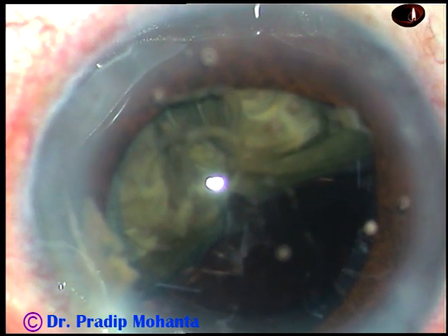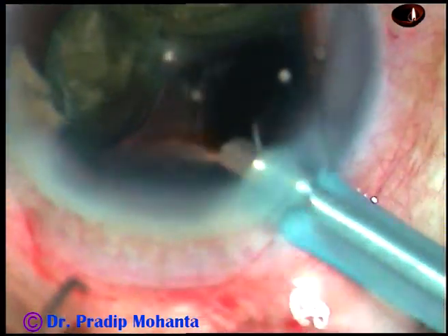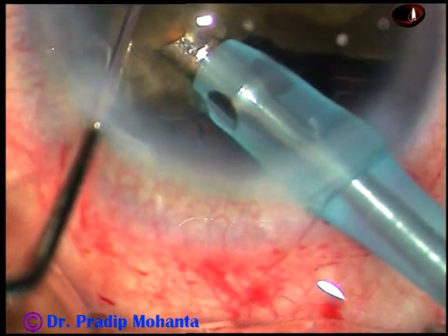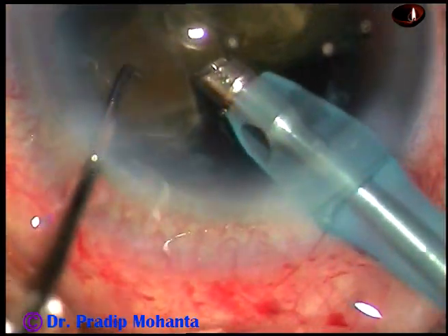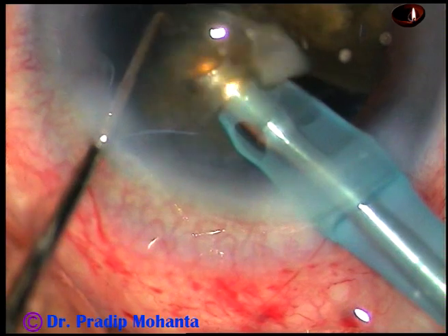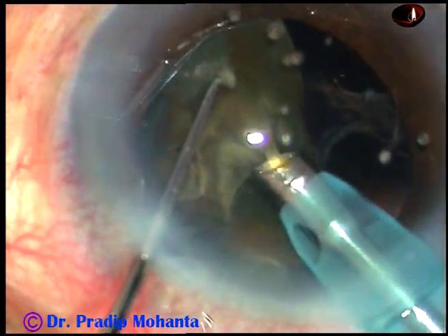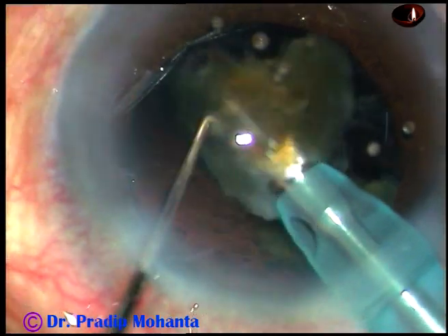After injecting some viscoelastic substance, I go into the anterior chamber and start emulsifying one of these two large fragments. The machine being used is the Oertli Cataris 3. The beauty of this machine is that even in this hard cataract — see the main wound — there is no wound burn. There is enough fluid on either side of the titanium needle, and with about 80% ultrasonic energy, there is still no wound burn. This is fantastic.